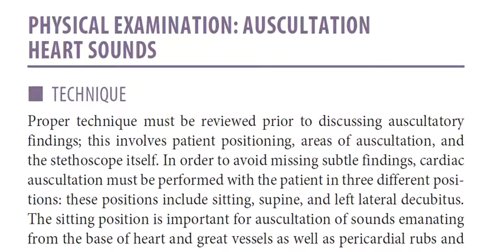Physical examination, auscultation, heart sounds. Technique. Proper technique must be reviewed prior to discussing auscultatory findings. This involves patient positioning, areas of auscultation, and the stethoscope itself.